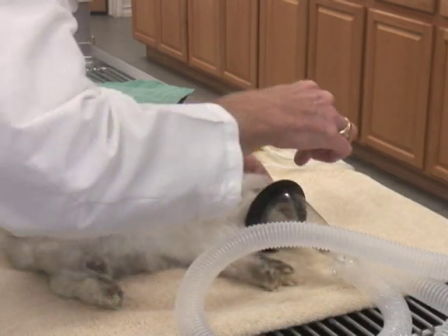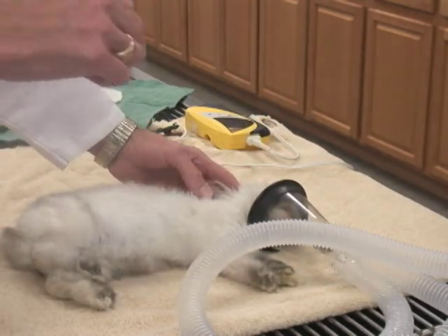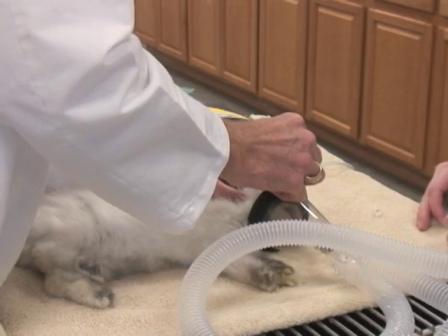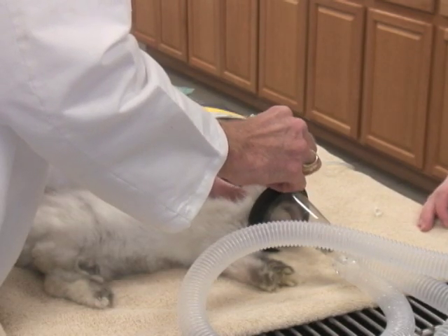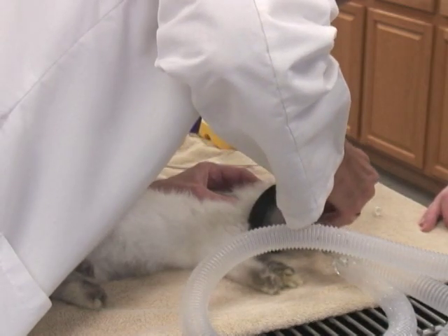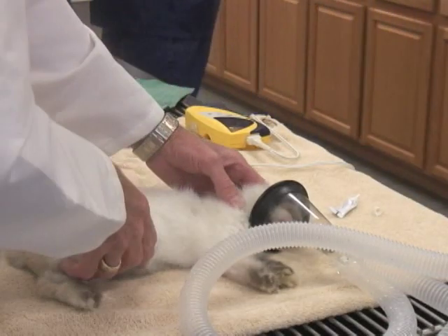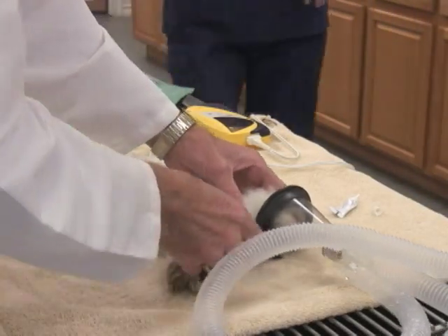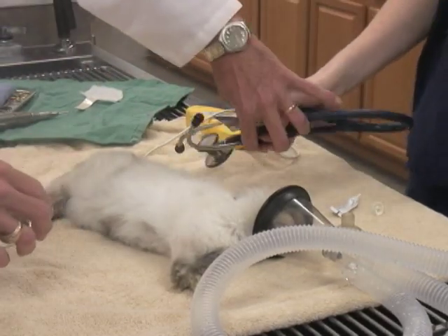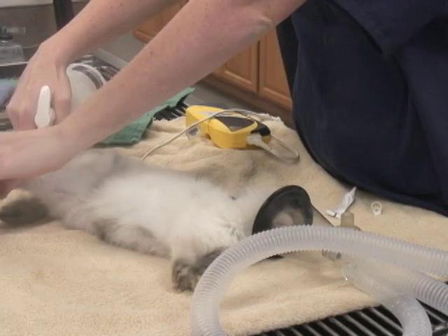We'll watch for a blink reflex — we generally use those kinds of things to determine anesthesia depth. Her blink reflex is greatly minimized. We're going to put some lubricant in her eyes and turn the gas down to about four to keep her at the right level. We'll switch to the little mask that we put on the nose. This is a pulse oximeter — it measures her heart rate and whether she's oxygenating, getting enough oxygen.